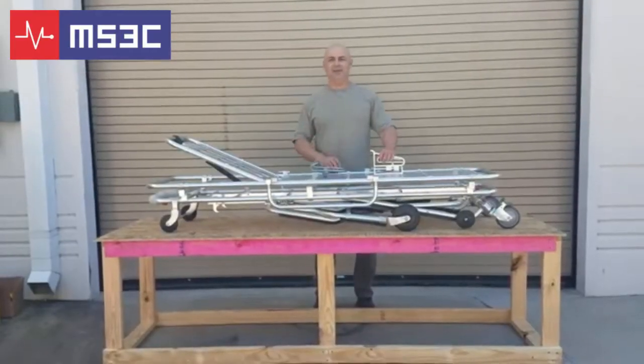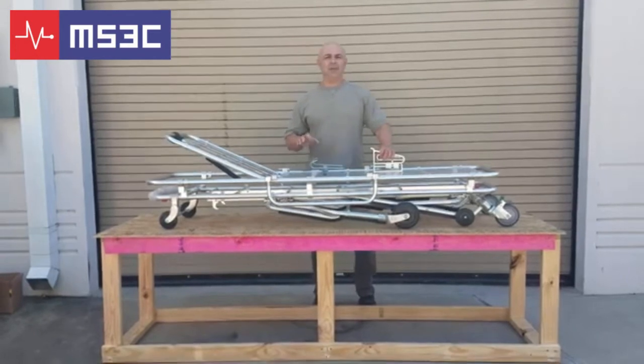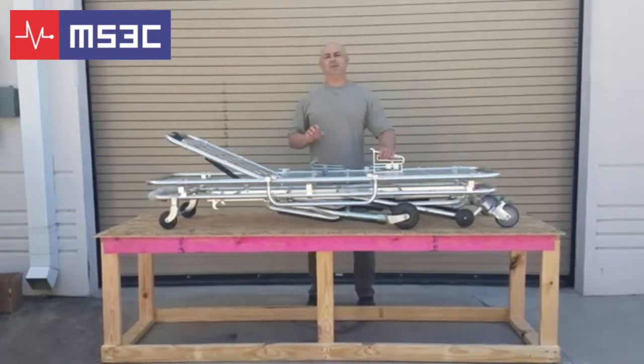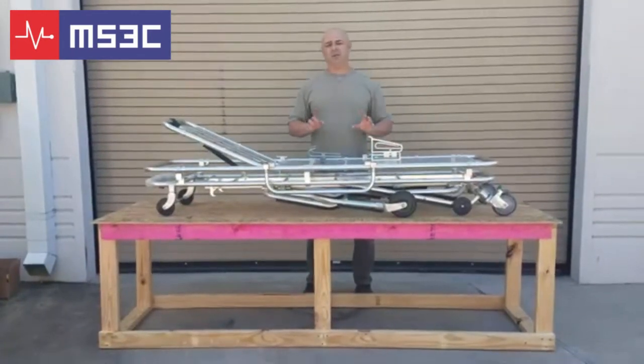Good afternoon, good day. We're going to take a few minutes today to show you how to install the catches for the MS3C light ambulance stretcher line. The process is extremely simple.